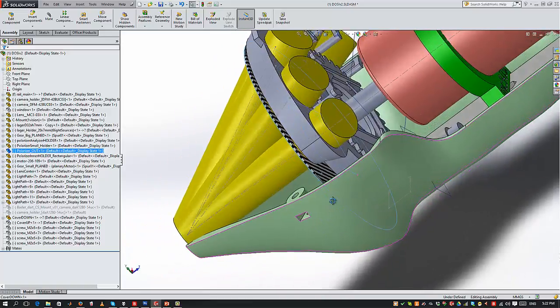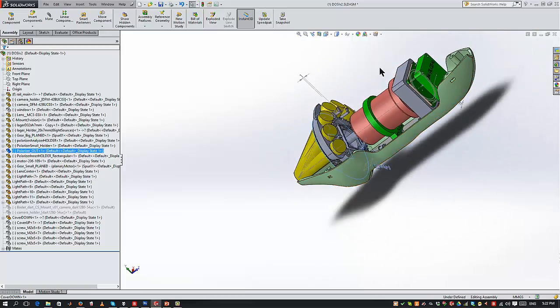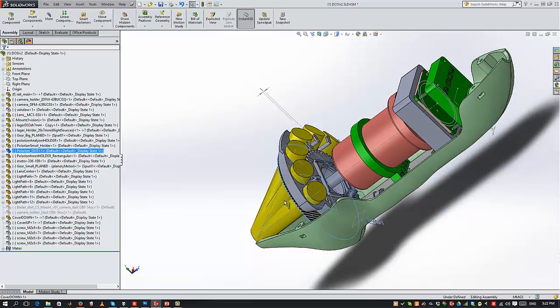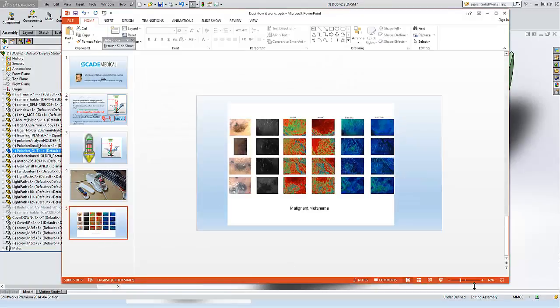In the middle, we have another polarizer that is able to transmit or actually block the specular light. So for each angle of polarization, we see the information underneath the skin. Then the camera gathers the whole information, and from now on the computer is doing the process of understanding the underneath distortion.